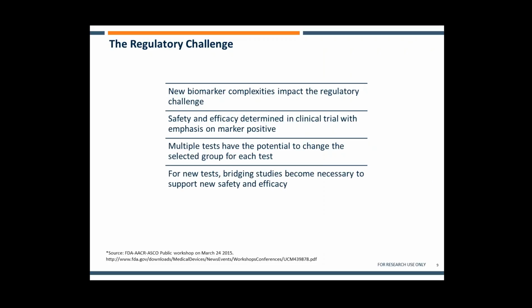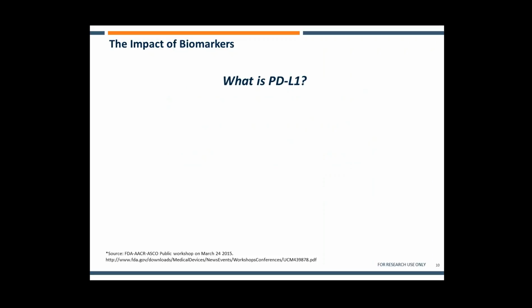For new tests, for new drug treatments, bridging studies may become necessary to support safety and efficacy. And there's the potential, as we go more and more away from the one drug, one assay, into a matrix of companion diagnostics, that there's a real risk of mismatched approved drug and device combinations, let alone without even considering the LDT scenario.